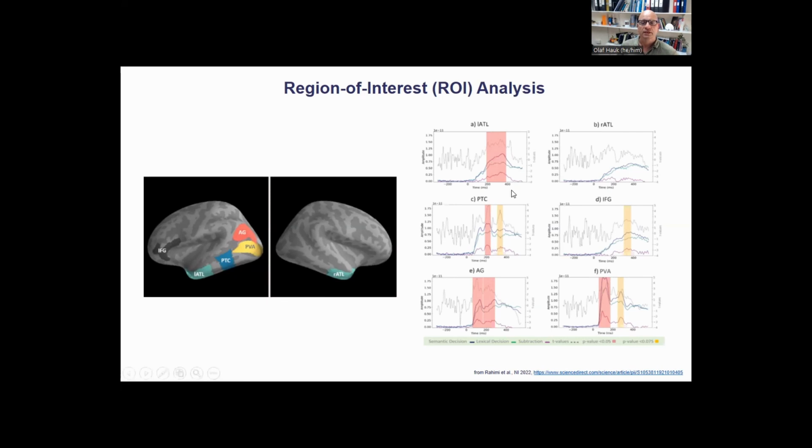And then you still have to decide how, I mean, this just shows you at an uncorrected level whether there is potentially a difference between these conditions. But as you probably know, there's the multiple comparison problem. The more tests you run, the more will be significant by chance. But just by eyeballing, you may see that some of these effects are not just randomly sticking out of your data. It looks like there is a longer time range with higher t-values. Not so much here. Maybe here there are some peaks that are higher than other peaks, maybe a little bit more temporally extended, so they might be true effects, and so on and so forth.